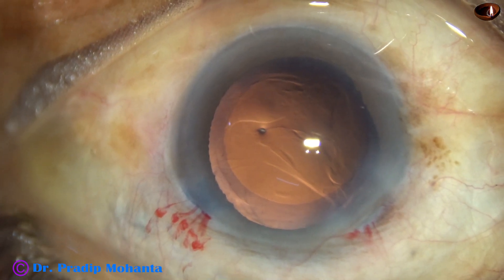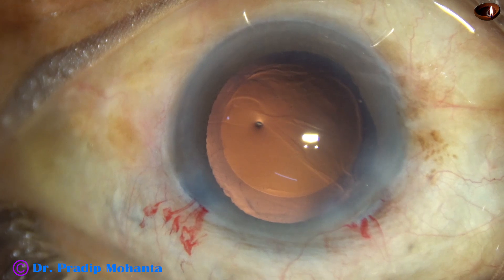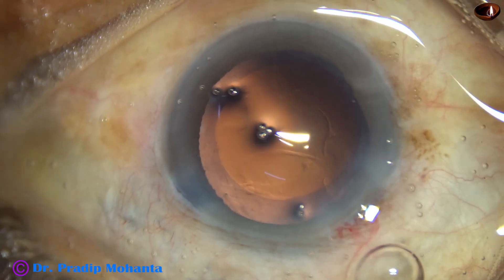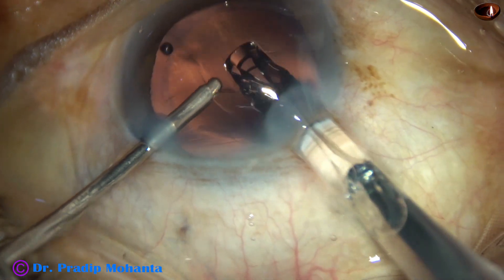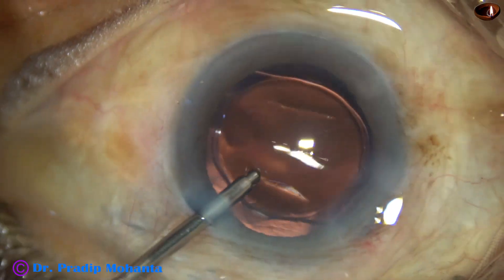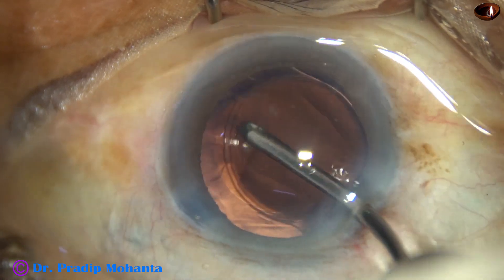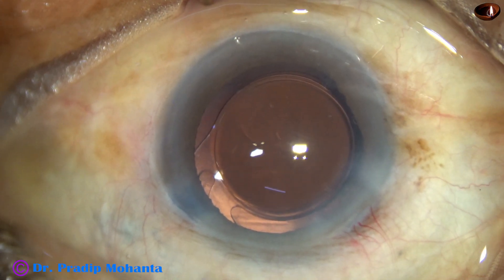Hydro-implantation of a single-piece monofocal intraocular lens is done. Before that, the main wound is enlarged just a little — by about 0.1 millimeter. The lens is placed in the capsular bag, and the intraocular lens is dialed to keep the haptics about 90 degrees away from the main wound.